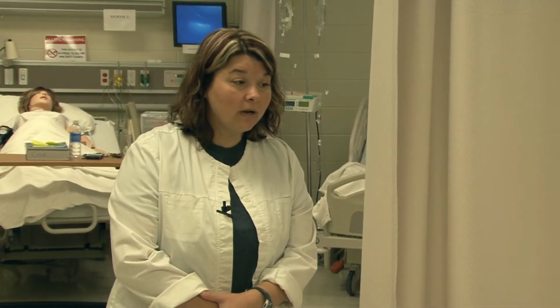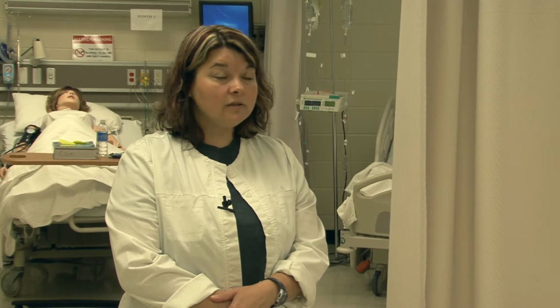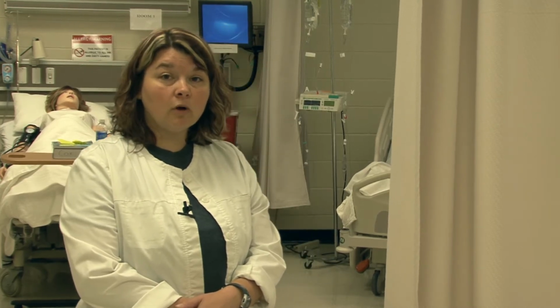So we're now ready to go into the room, and of course I would have wanted to have gathered my equipment before I went into the room. But I also need to assess the patient and their IV access as far as the veins and the size of the veins. So we're going to do that when we go into the room, and we'll talk about that.